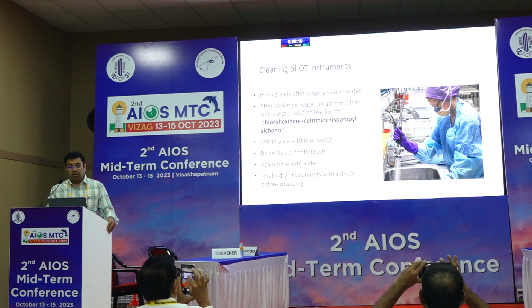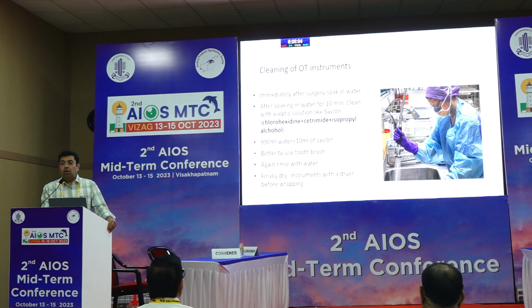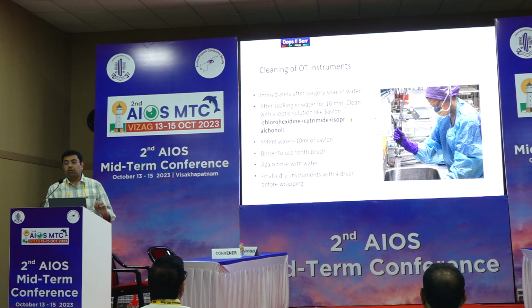Savlon, I think it's a mixture of chlorhexidine, cetrimide and isopropyl alcohol. And you should see that you clean all these instruments with a toothbrush, so that you are eliminating all forms of any dirt or anything which were used in the operation theatre.